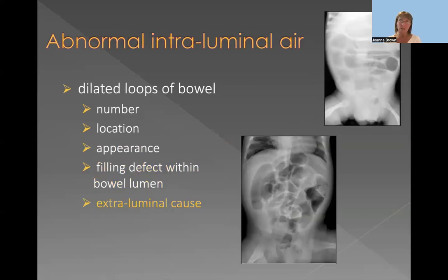And we can also have extraluminal causes of bowel dilatation and obstruction, and especially in boys it will be a hernia. You know, when the testes descend into the scrotum, we very often have an open inguinal ring in boys, and when it's open with a hernia, a loop of the small bowel can easily migrate there, being stuck and causing the obstruction.